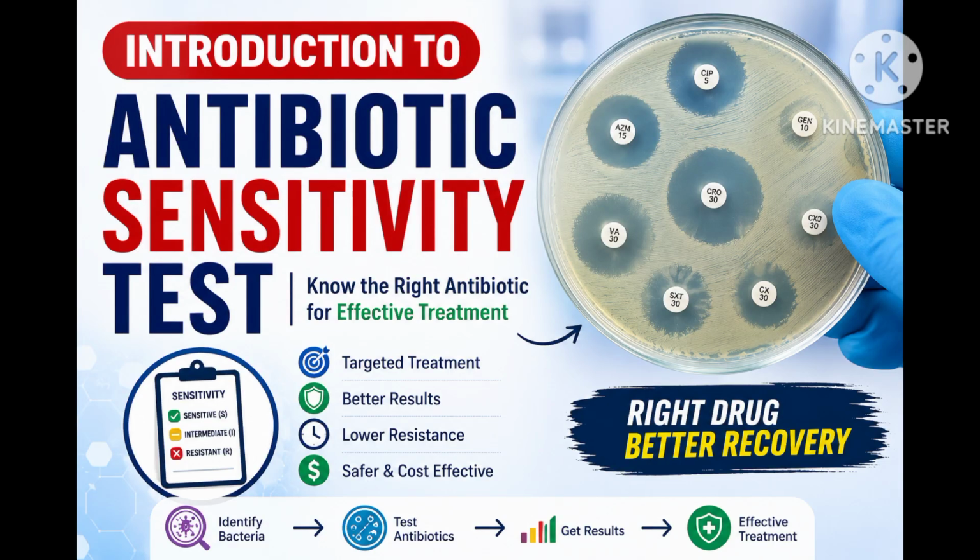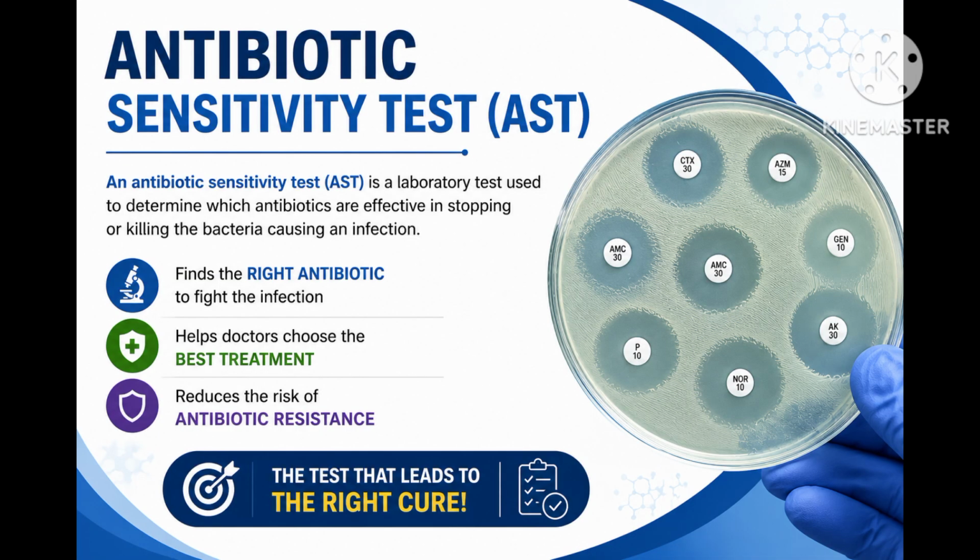In today's video, we will learn about the Antibiotic Sensitivity Test, also known as the AST. This is one of the most important laboratory tests used to identify the most effective antibiotic for treating a bacterial infection. What is an antibiotic sensitivity test?